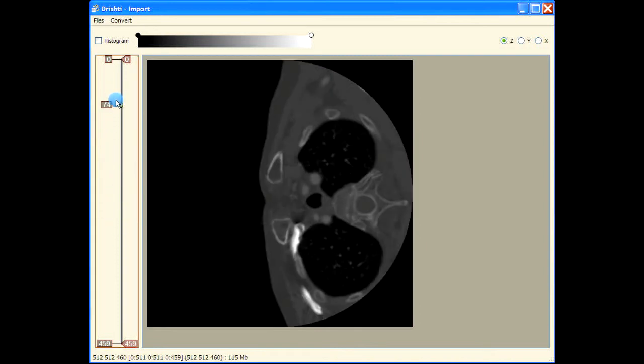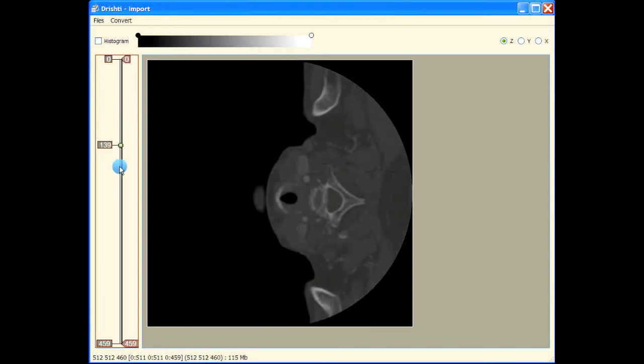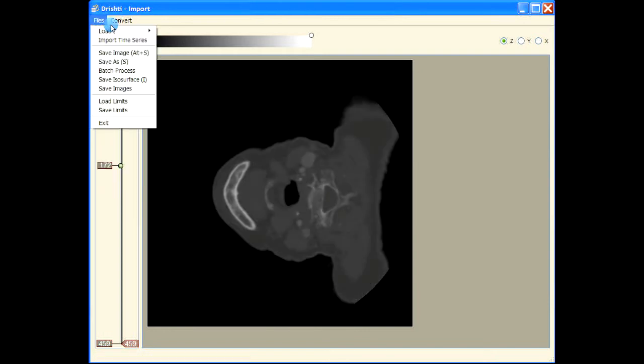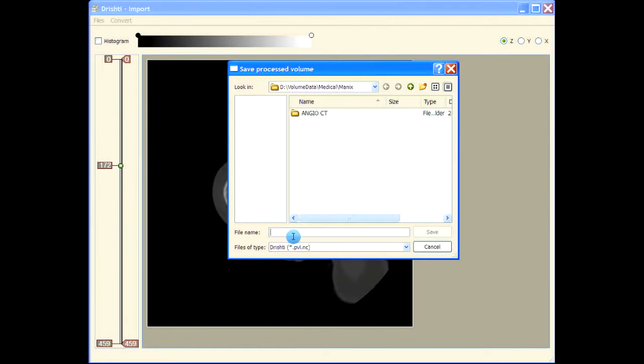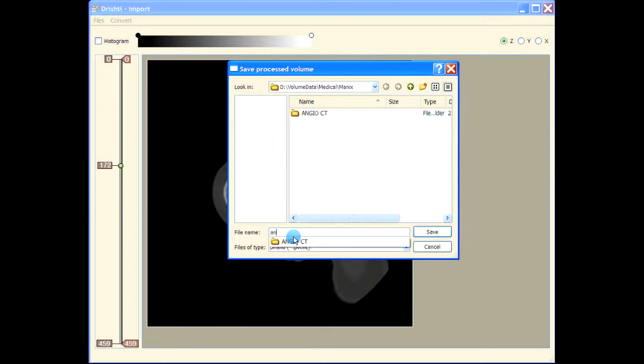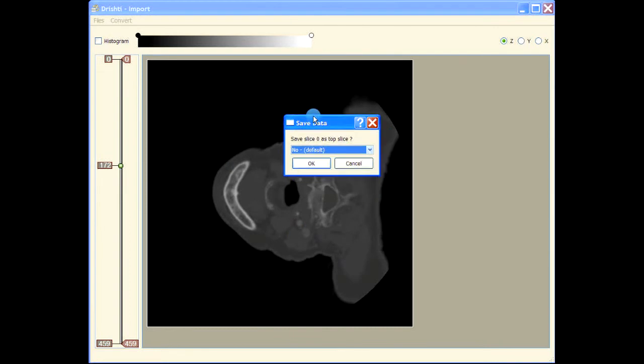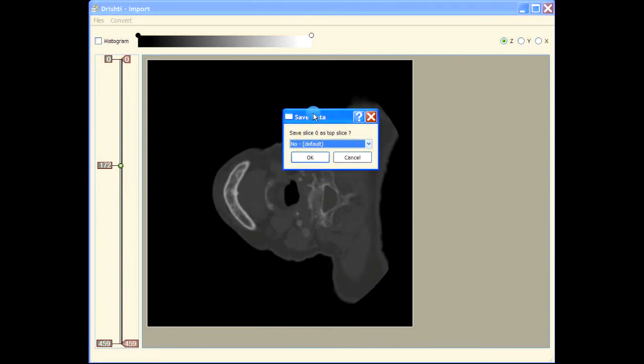Let's save the data now. Save as. Now, based on your image stack, we can take the top slice as the zero slice or top slice as the last slice.